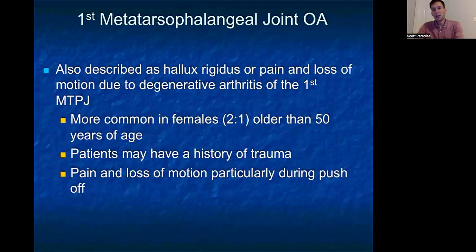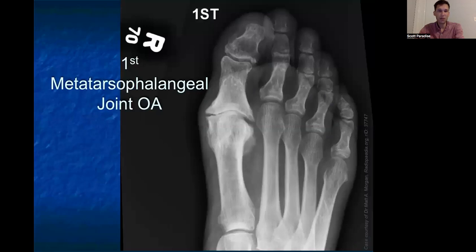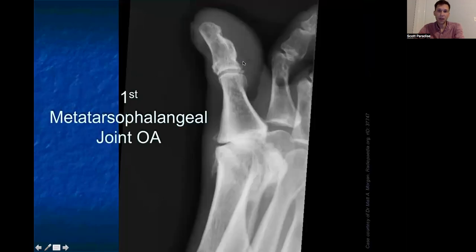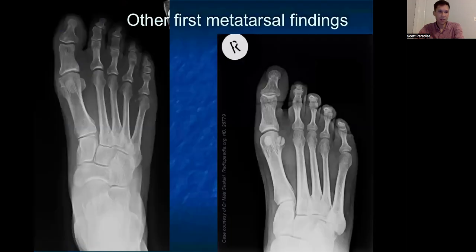The last topic we're going to discuss is first metatarsophalangeal joint arthritis — a very common cause of first MTPJ pain, more common in females and as you get older in age. On this blown-up dorsiplantar view, we see subchondral sclerosis, loss of joint space, and bridging osteophytes. On the lateral view we see the same: osteophytosis, loss of joint space, and subchondral sclerosis. Things we also want to make sure we don't miss: a periarticular erosion on the left, and a fractured sesamoid on the right — conditions we want to keep an eye out for as well.